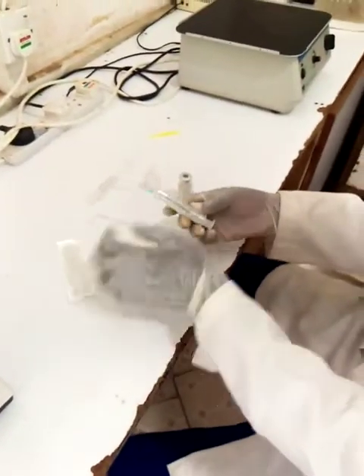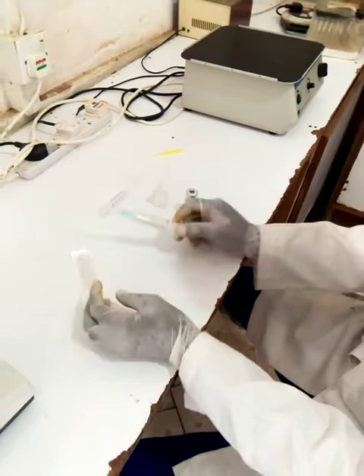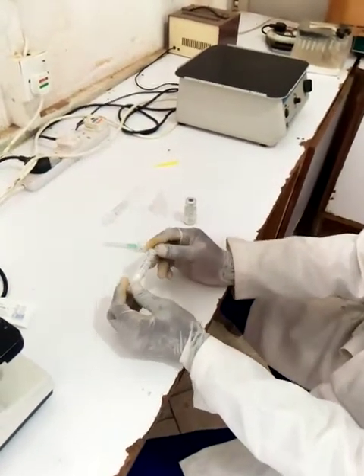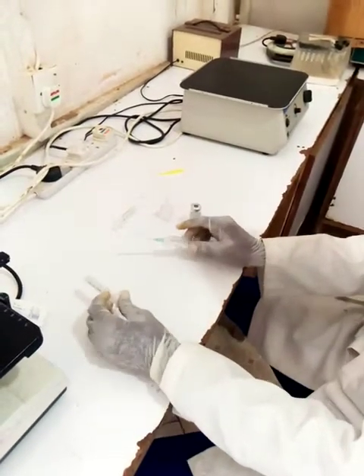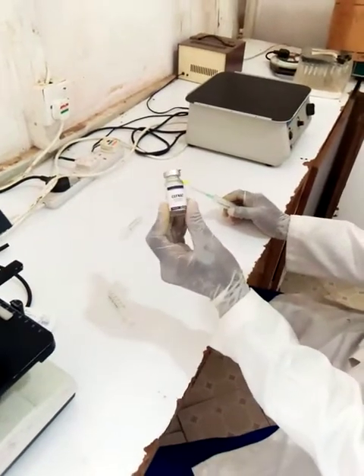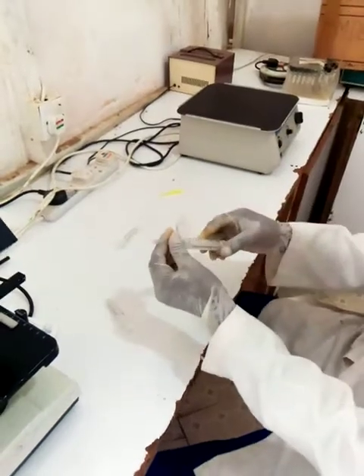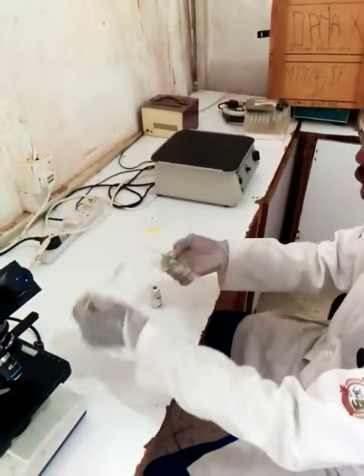First you must have a 10ml syringe. Also we have here a 5ml syringe. I am going to mix the vial of Ceftriaxone and the water for injection — 10ml. I am going to do some practical with 10ml, so I remove it here.